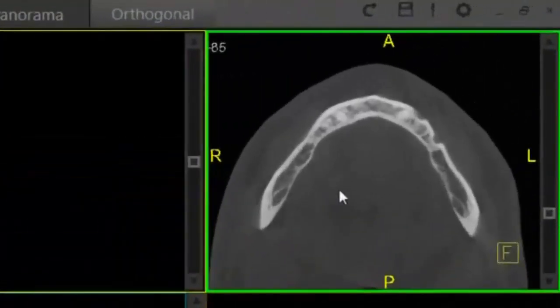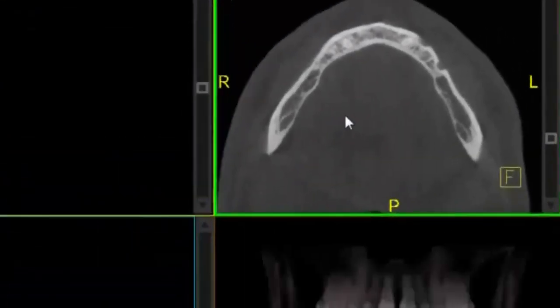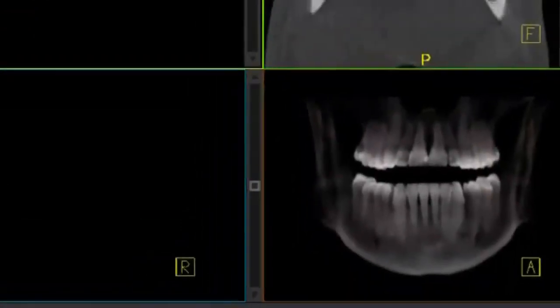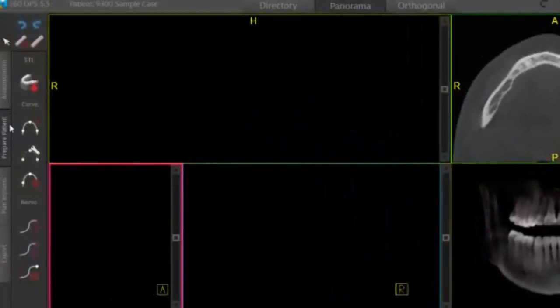You can see we have our axial view here to the top right, and then below we have our 3D volume. The software actually starts us in the Prepare Patient tab, and under that tab you can see we have our curve drawing tool and our nerve mapping tool below.